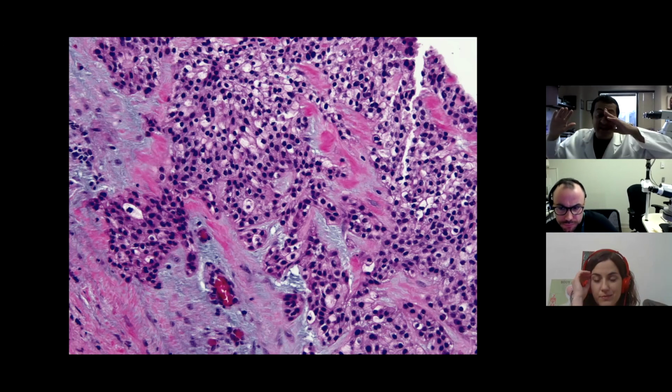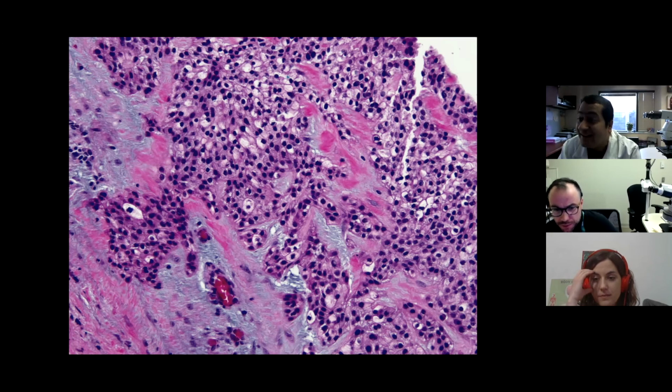So I'll say here that there are no other surprise findings after this. This is it. The EWSR fusion was diagnostic of this lesion. I initially thought of salivary gland type things. Yeah, you're on the right track. And with the P63, that would be in keeping with it, but I'm not sure which salivary gland has an EWSR fusion. That was actually interesting, we just had a PPS case of the month a month or two ago with this lesion. Maybe it wasn't a month or two ago, maybe within the last year. Behind on my PPS cases, I guess.